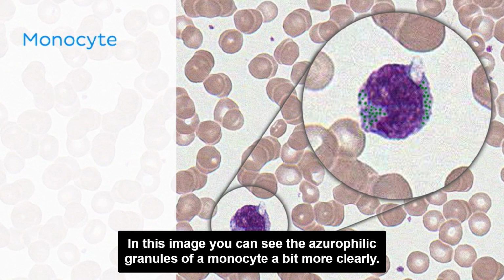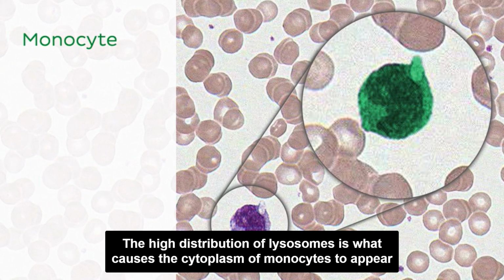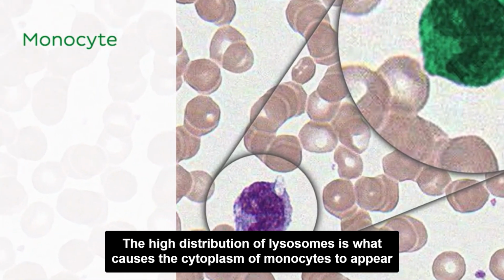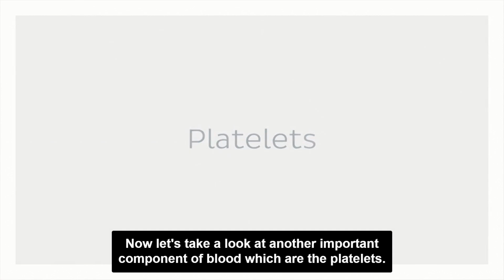In this image, you can see the azurophilic granules of a monocyte a bit more clearly. The high distribution of lysosomes is what causes the cytoplasm of monocytes to appear bluish in colour, as you can see in this micrograph. Now let's take a look at another important component of blood, which are the platelets.